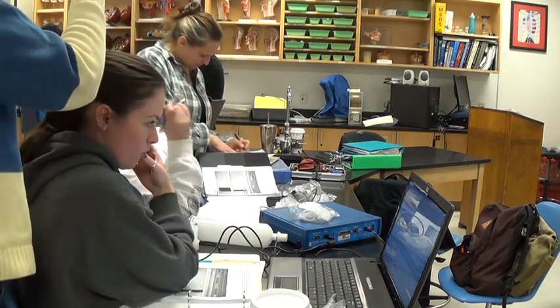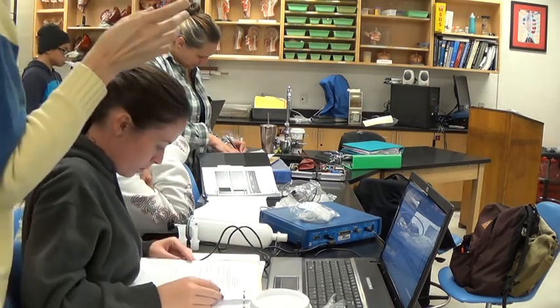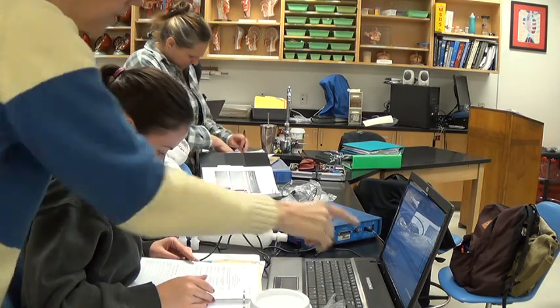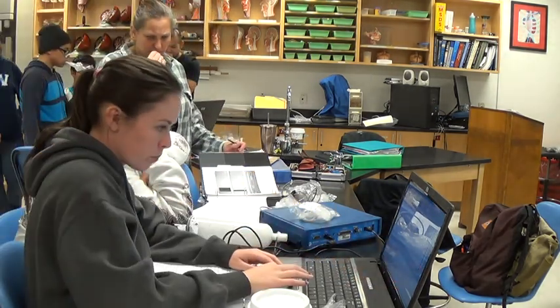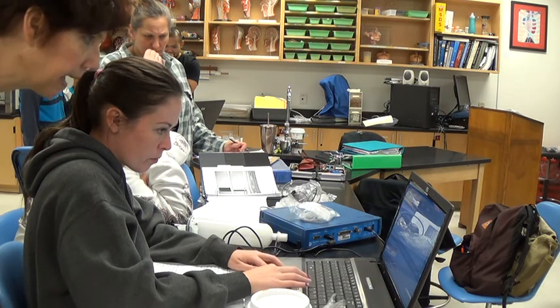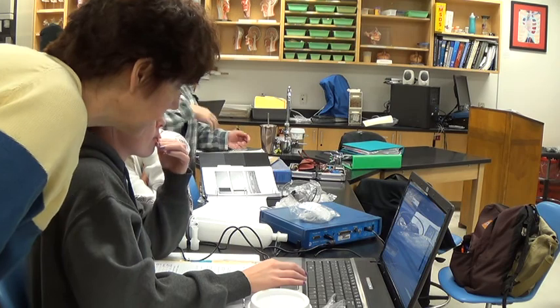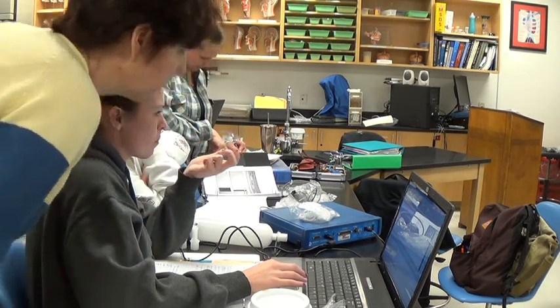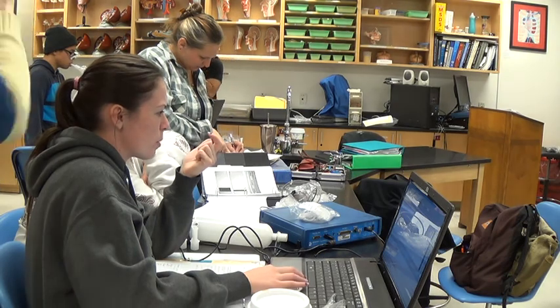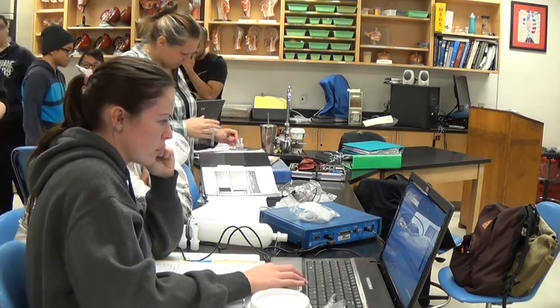So you're going to put a percentage down, so you're going to take 2,280 divided by. Exactly. So now do that again, but go all the way to the bottom. Don't worry about the time, just go all the way to the bottom. All right, and now your PP is 4.27. So you're going to divide 2,280 by 4.27. That will give you a PP percent. But does that mean that we should go back?